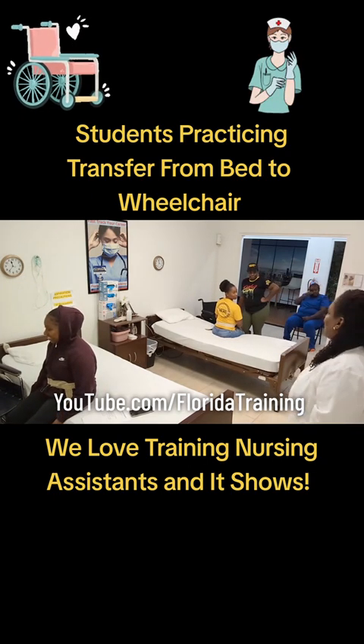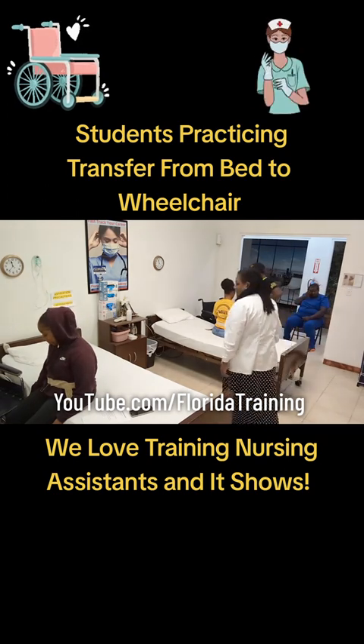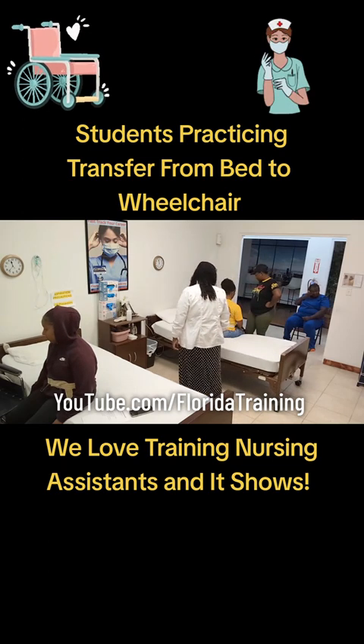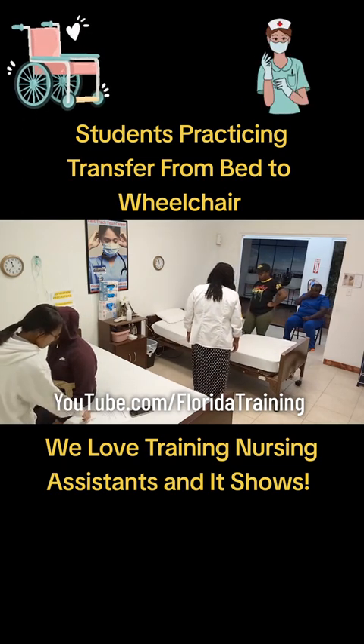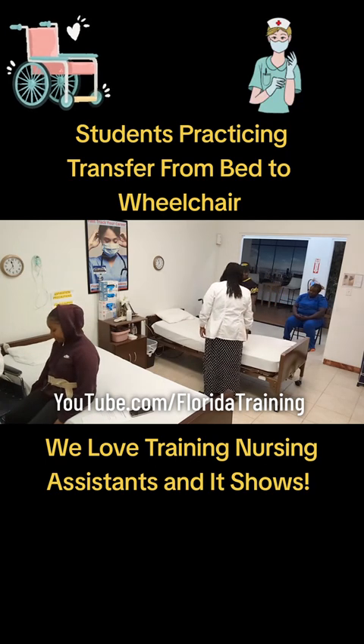Now, the leg nearest the wheelchair — don't block the wheelchair. The leg nearest the wheelchair goes behind you. The leg furthest away from the wheelchair goes in between there. The one that's nearest the wheelchair — you don't want to trip it. Good job.